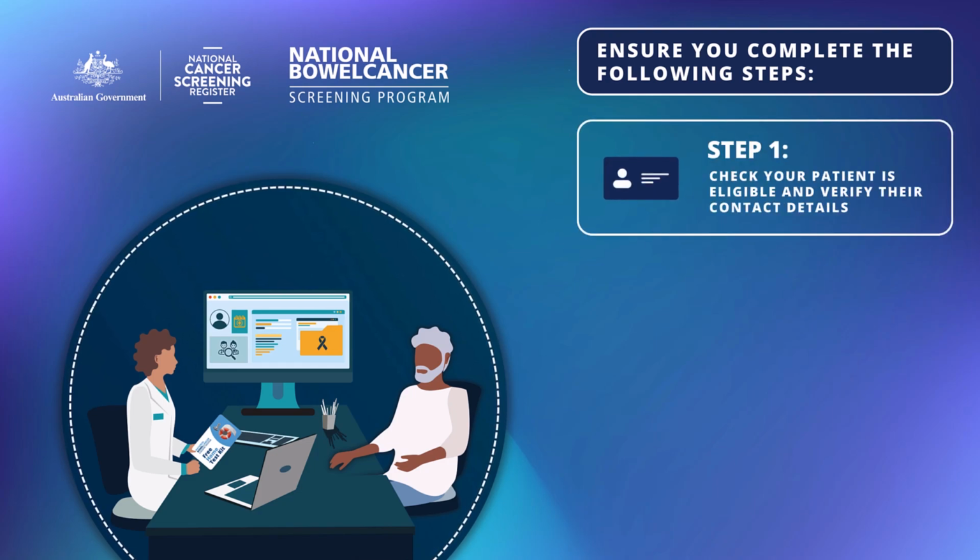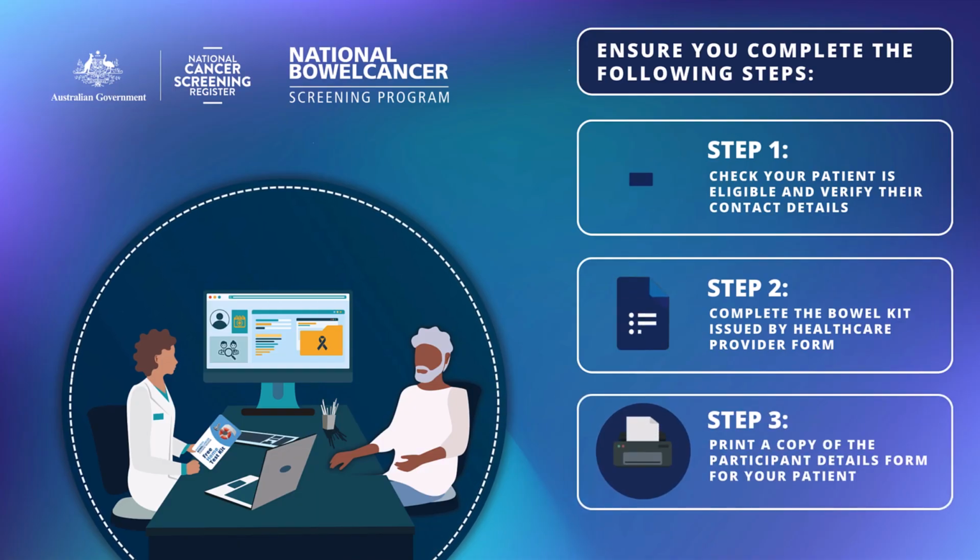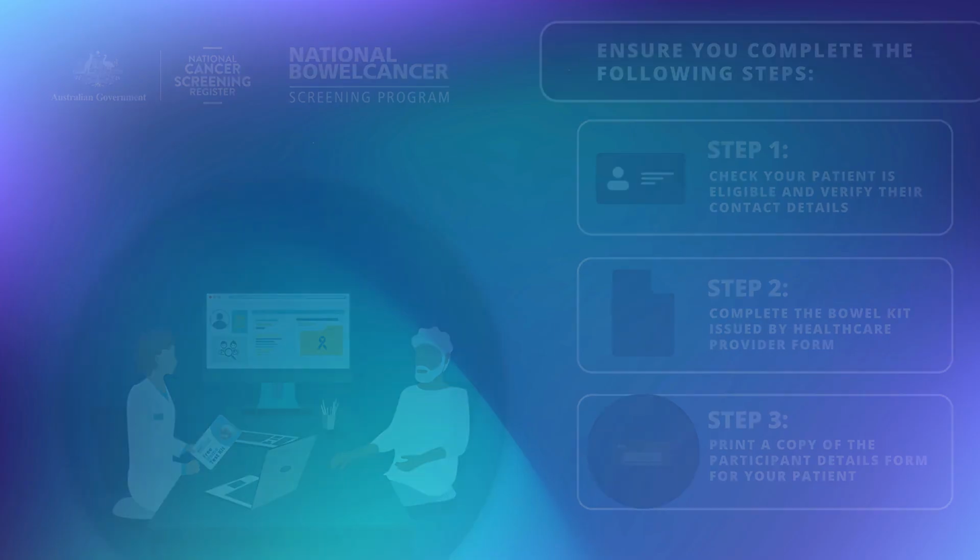First, check that your patient is eligible for the bowel screening program and hasn't screened in the last 2 years, and that their contact details are correct and make any necessary changes. Then, complete the bowel kit issued by healthcare provider form to generate a unique pre-populated participant details form. Then, print a copy of the participant details form and give it to the patient to sign and include with their samples in the reply paid envelope, which is enclosed in the kit.